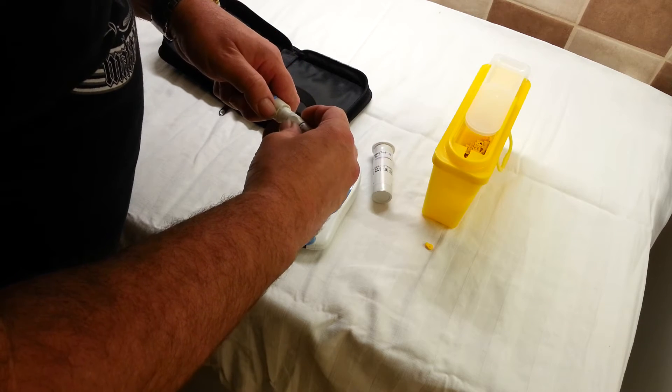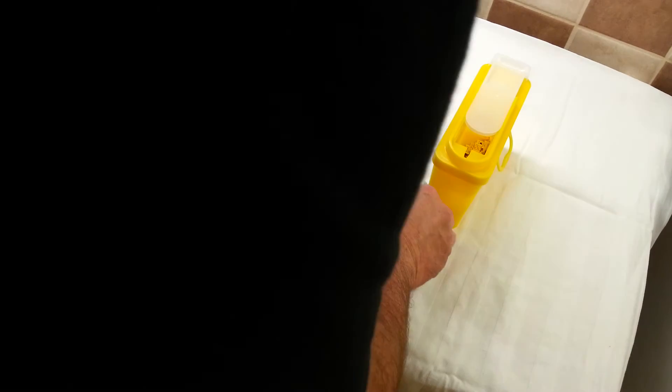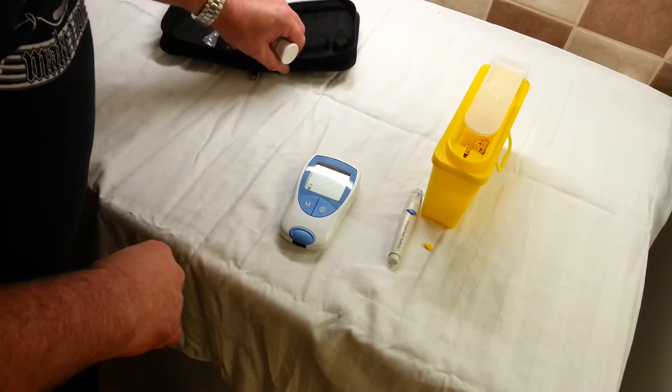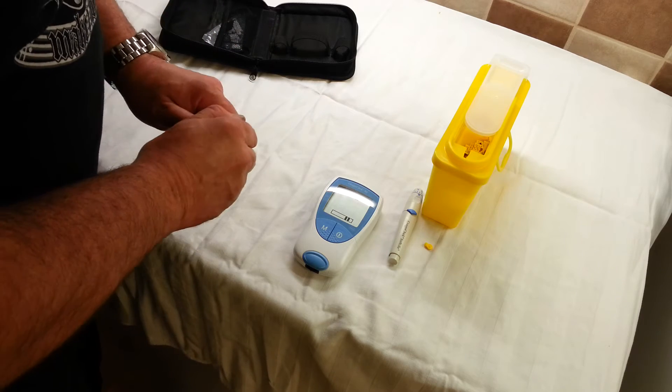Make sure it's clicked down properly, otherwise you just end up sticking it in before you want to. When you turn the machine on it goes to a quick start-up routine, and then the flashing light is just telling me to put a strip in.